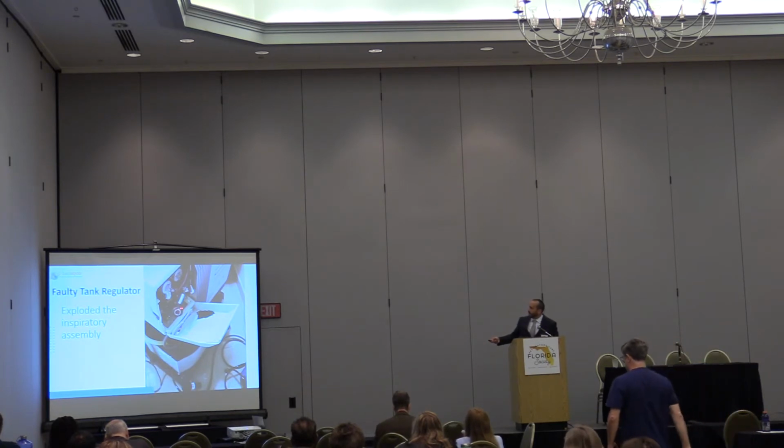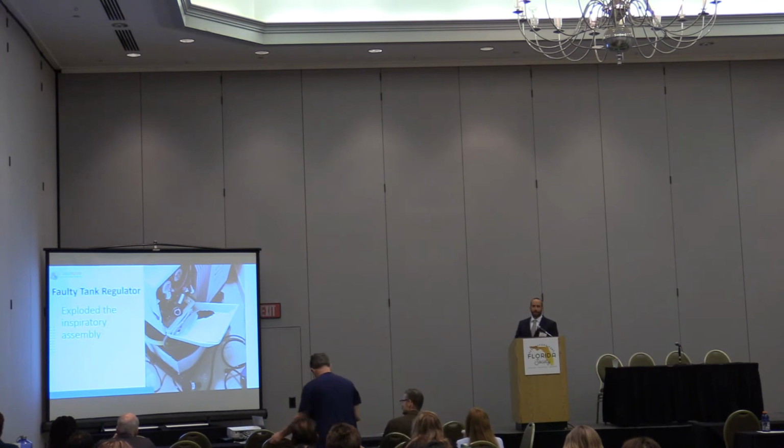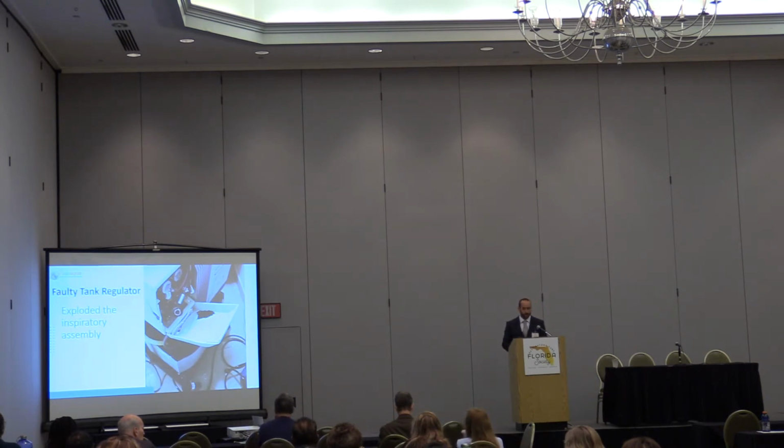Exploded. Here there's an oxygen filter and a cap. It shot a hole out the back of the ventilator and just destroyed everything. I'm sure it was terrifying to whoever was there. Luckily, no one was hurt.